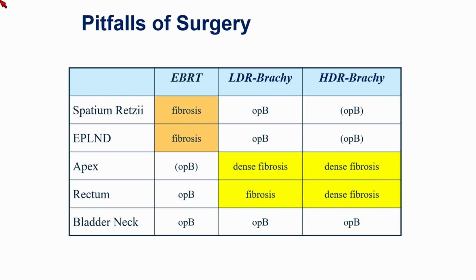I have a video on radical salvage prostatectomy, but that's not the main issue of this talk and this presentation, so I guess we can skip this. The bottom line message is to use this type of PSMA PET scan in the scenario of locally recurrent disease. That's all for my small presentation on local recurrent disease.